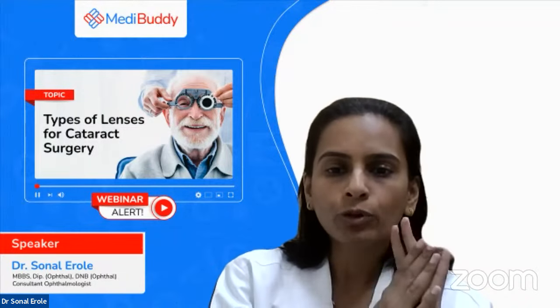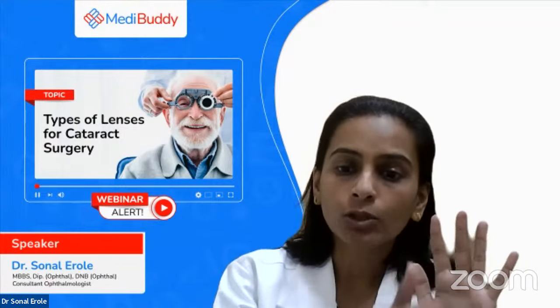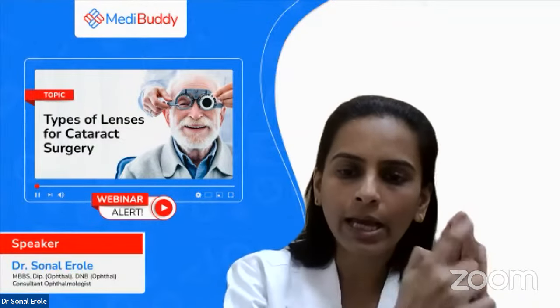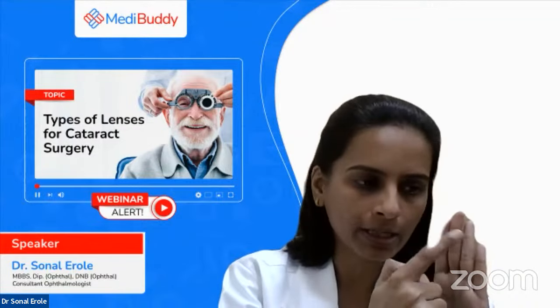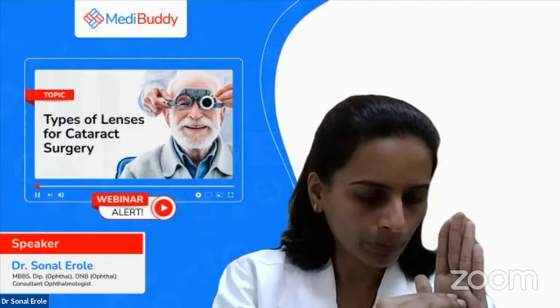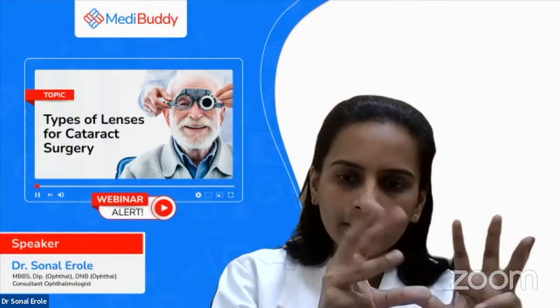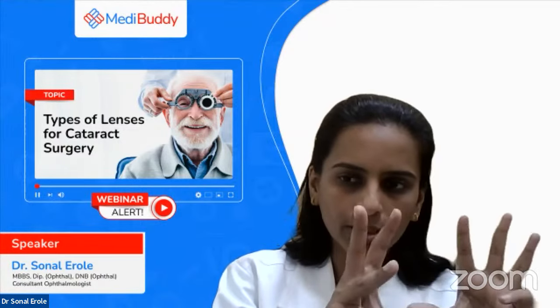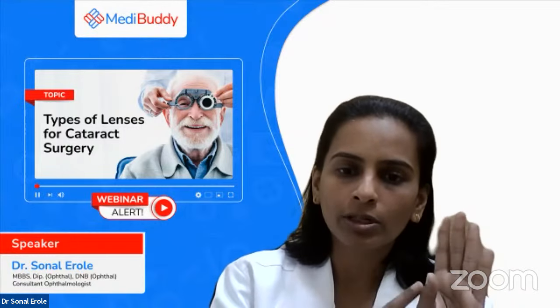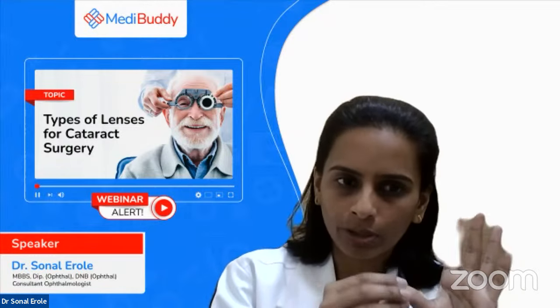So multifocal IOLs, as I already said, have power included in them. Basically, a monofocal lens is a plain lens, while the multifocal lens will have all the powers in a zonal format. They have different zones in them, the distance one, then the intermediate one, then the near. Depending upon your pupil size, as the pupil size decreases or increases, they have all these power gradations. So with multifocal lenses, you do not need to wear glasses. That is the first important benefit of multifocal lenses.